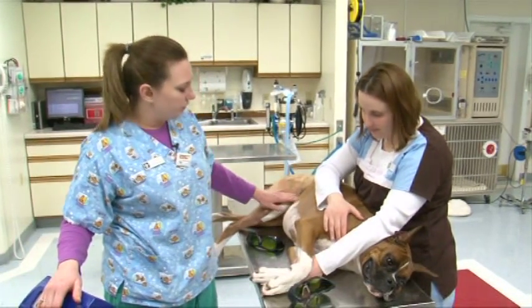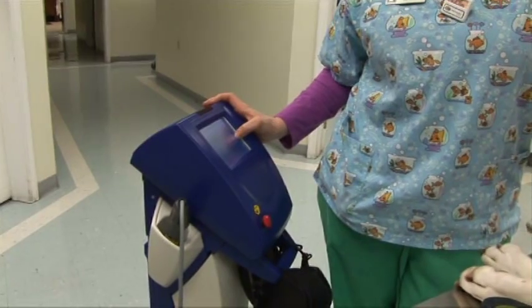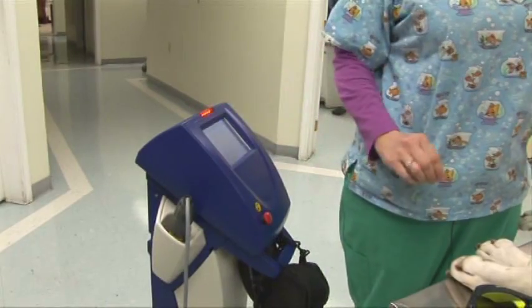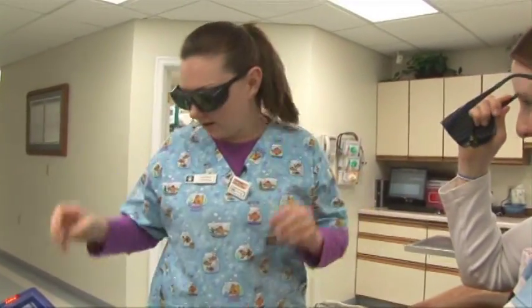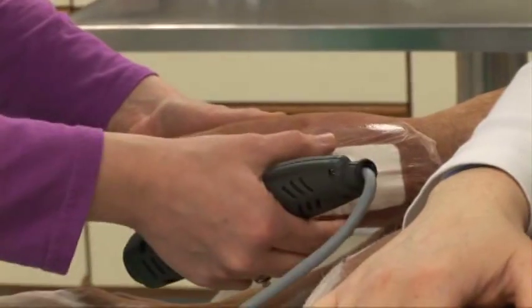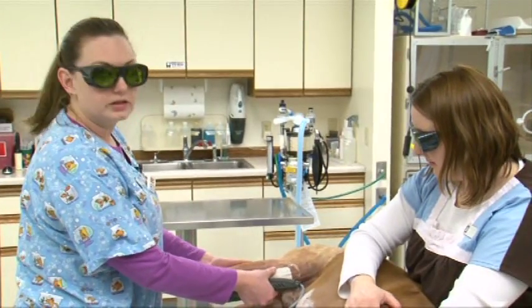It will be the point-to-point and it takes about two and a half minutes. You just scroll down to the correct treatment time, hit the start button, and it tells you that it's ready. Then everybody in the room has to wear the pretty little goggles. With the laser treatment you want to take about the size of a business card for where you're going to be treating. Because his is post-surgical, it's going to be right along where the incision was.